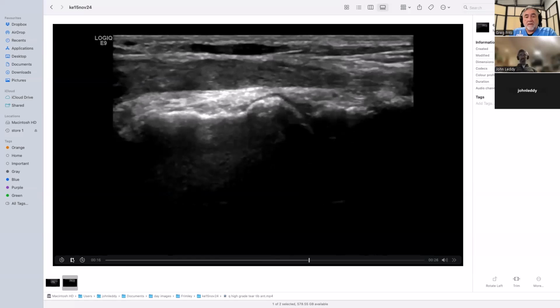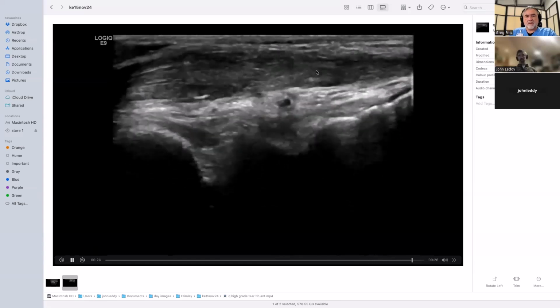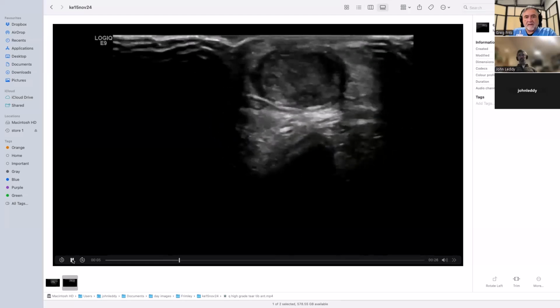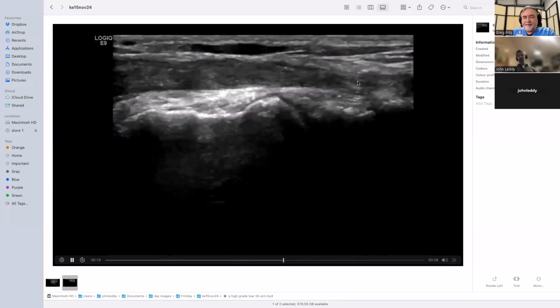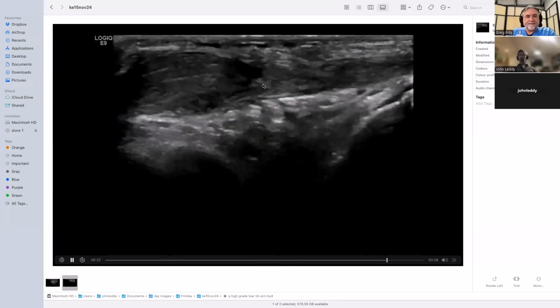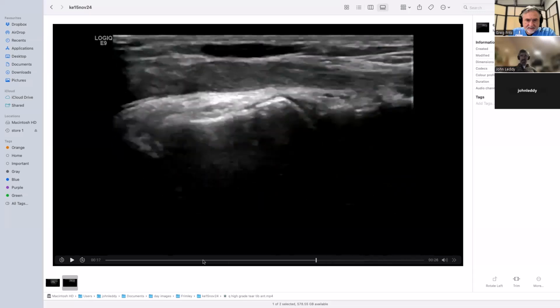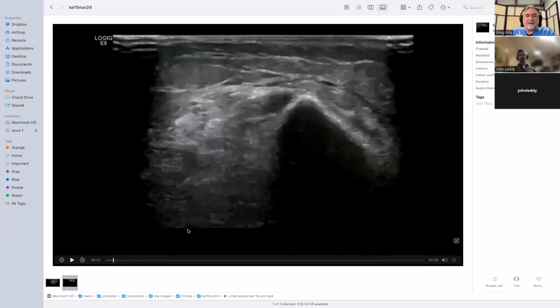All right. Now this is tibialis anterior. I was slightly skeptical. I wonder whether this is a ruptured tibialis anterior that has then scarred up a bit like an Achilles will if it's left, because I find it hard to believe that you get a partial tear that would look like this, but it just thins right out. But then you feel like there's tendon running all the way down there of some sort, but it doesn't look like normal tendon at all. So I think this is just ruptured back, and whether a few fibers were left. Sometimes with tib post, you get it behaving like that, where you certainly get bridging fibers across there. But if we go back right to the start, you'll see there's quite a lot of atrophy within the muscle. We can't see a lot of the muscle there, but it doesn't look like healthy muscle. So I think that's what we've got there.